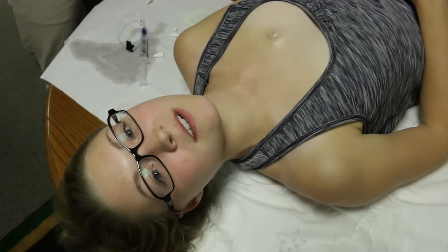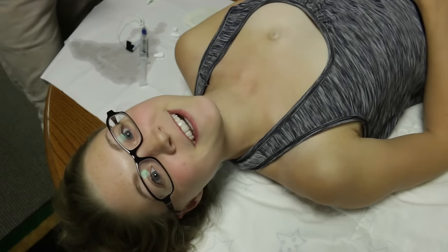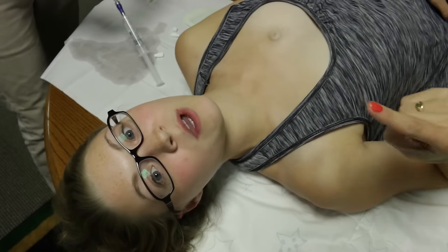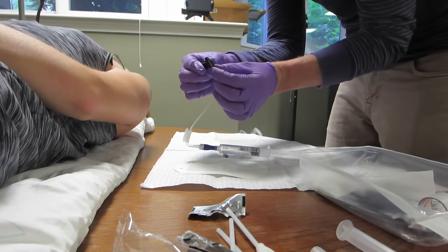Right before you stick the needle in, spread the skin and brace the port — really important. My port wiggles quite a lot so it's critical to hold it in place. With one hand bracing the port and the other inserting the needle, make sure your skin is clean and sterile so don't touch it anymore. Everything must be done with sterile gloves. Hold the two wings of the needle to get a secure grip.